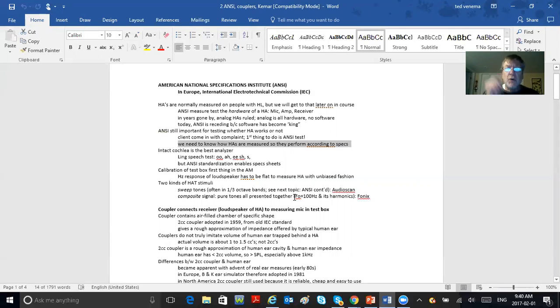Now, your intact cochlea is by far the best analyzer of any hearing aid. I mean, there was a guy by the name of Ling. He was not Chinese, I believe he was English, but his last name was Ling, okay? And he would take the hearing aid and listen to it through the stethoscope, the stethoclips, and he would go, ooh, ah, ee, sh, s. And that's a good speech test to talk into a hearing aid microphone. Ooh is low pitch, ah, a little bit higher pitch, ee, a little bit higher, sh, s. And you're going through all the speech sounds from bass to mid to treble, and listen to the hearing aid to hear if it's distorting.